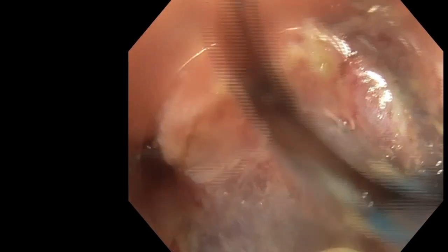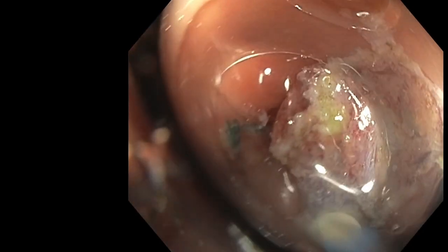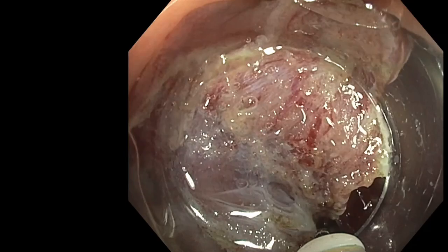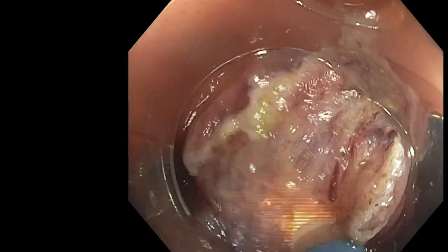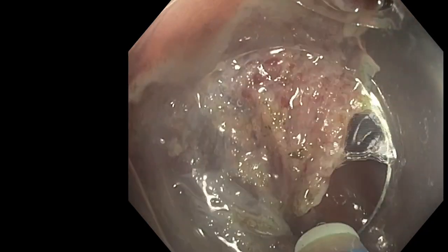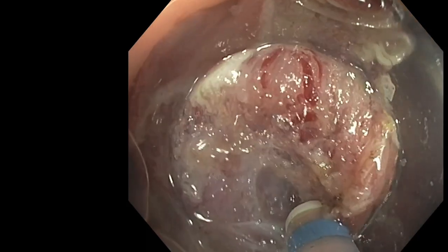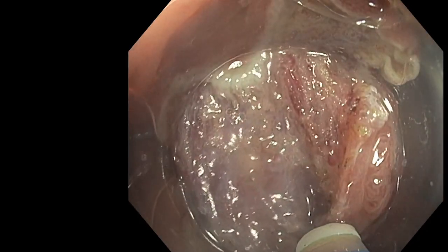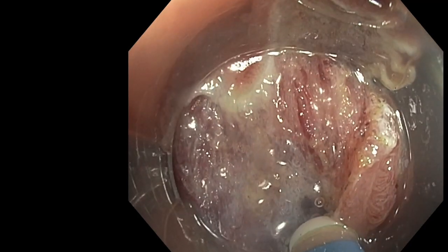Yeah, it needs training to recognize the muscle layer attracted by the traction, you're right, but nevertheless, for me, it's better to see exactly where we are and where is the submucosa, even if the muscle is attracted, than doing only blind movements, which are somehow dangerous if you do all the procedure without seeing very well.